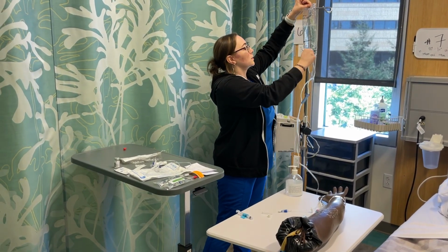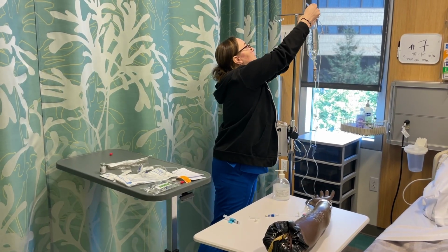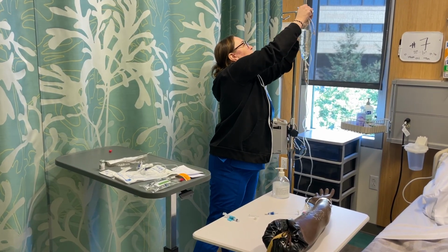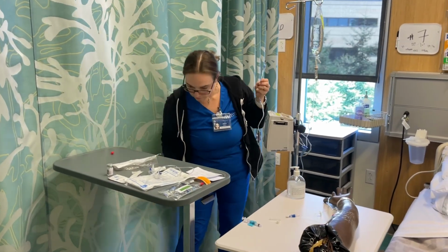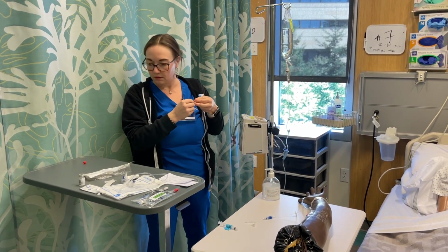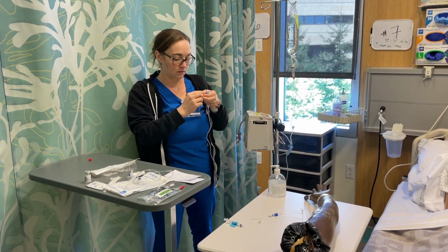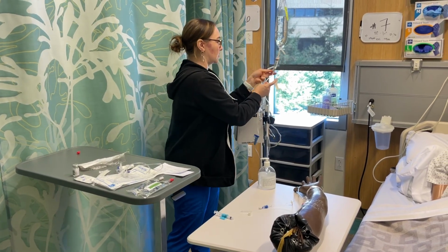Okay, and it is labeled on the back, and I'm also going to label the tubing. And label the tubing on here, go up toward the top.